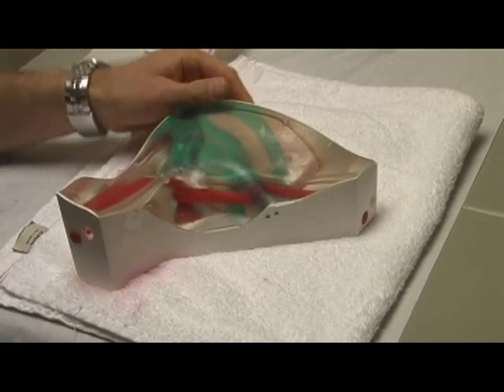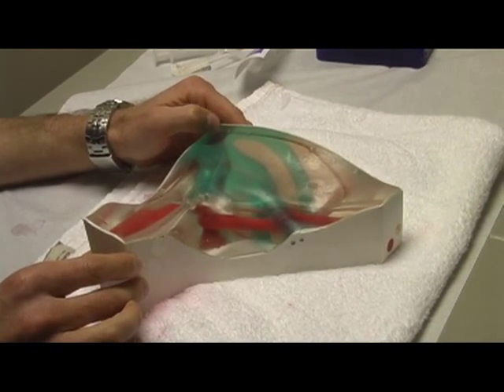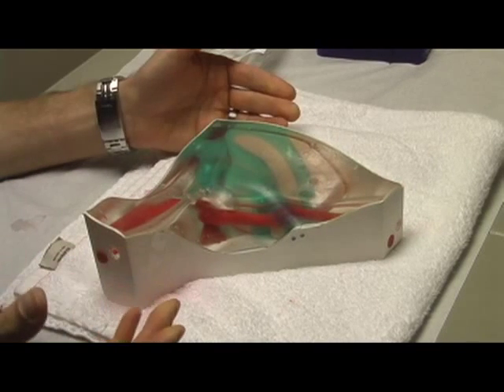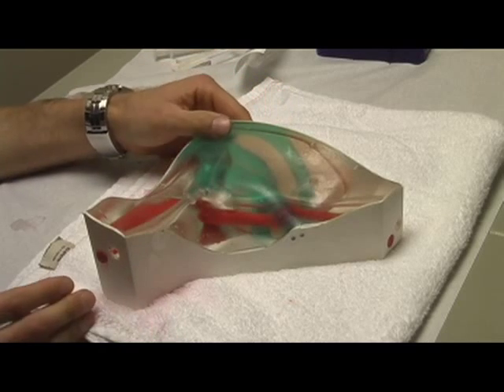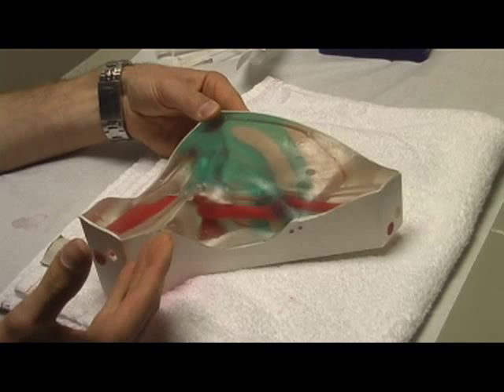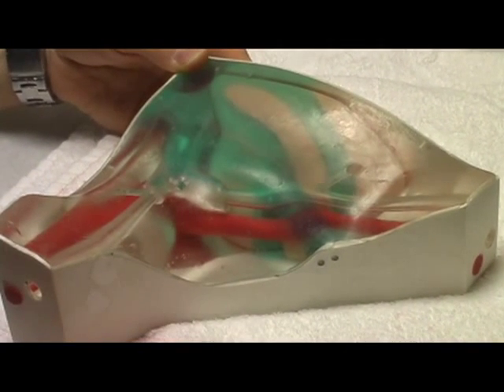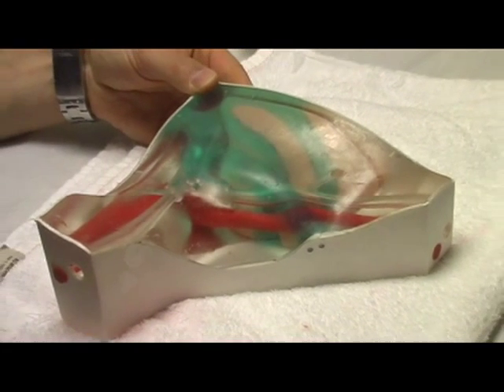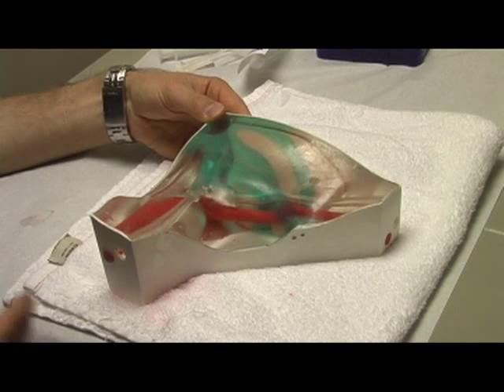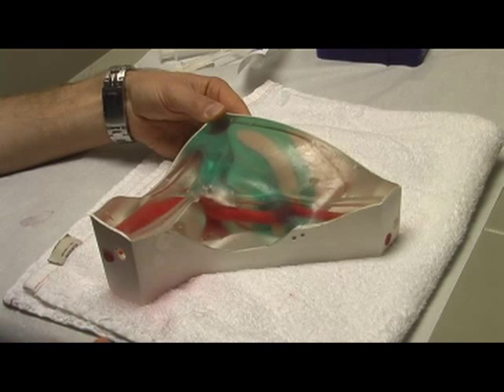Currently, this is a model that the students use during the CSIE experience to learn more about placement of central lines. One unique aspect about it is that it is a transparent model, so you can look into it and see where the vessels might be and what the internal anatomy looks like. So in a way, I guess it kind of mimics ultrasound, however, in that you can look internally, but obviously has some limitations.